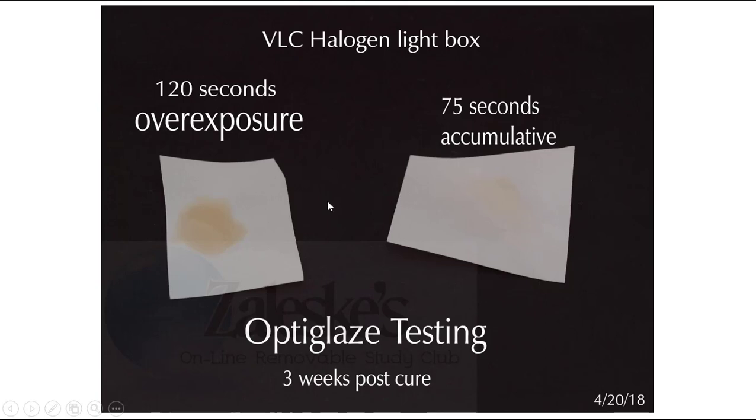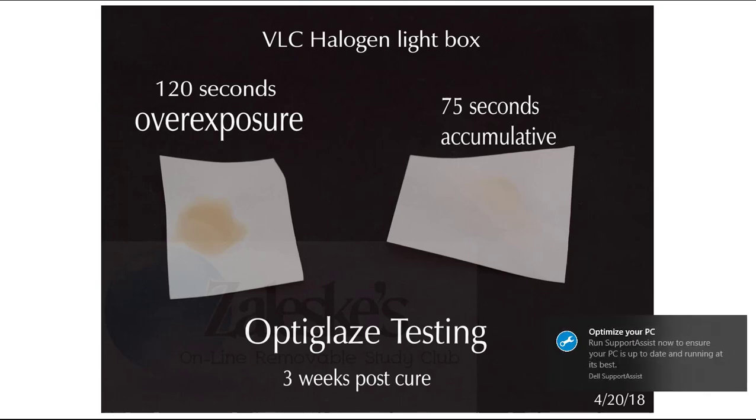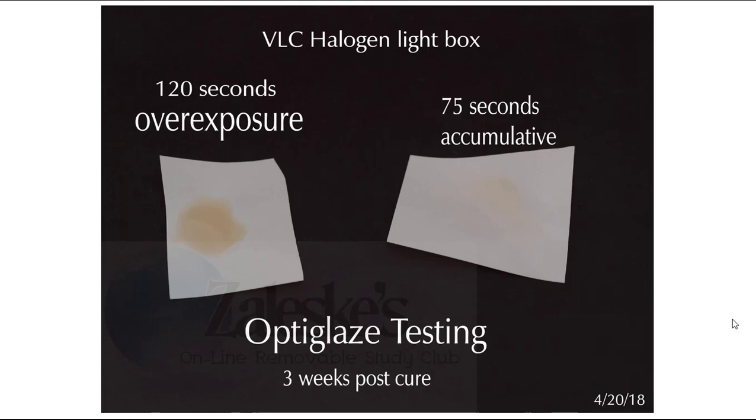Then once they were both exposed, I stuck them in a drawer for about 3 weeks. And I put them in a drawer because I wanted to imitate the darkness of the oral environment, and there was no need for it to be involved outside of in the light, because I didn't want outside ambient light to affect it.